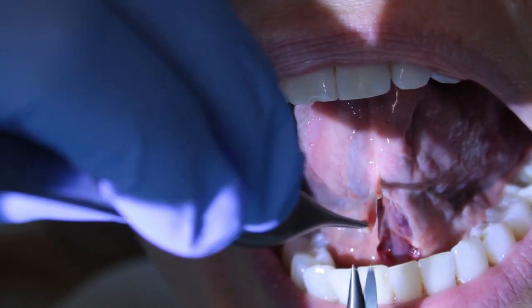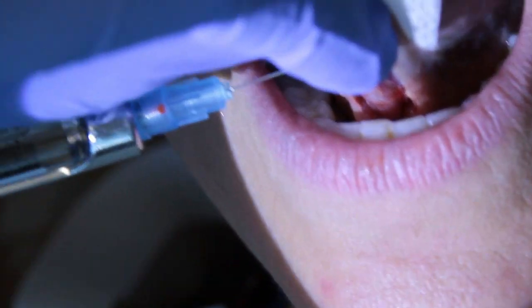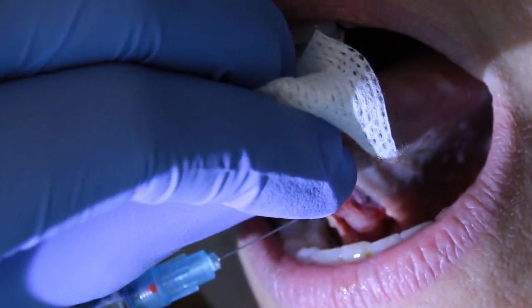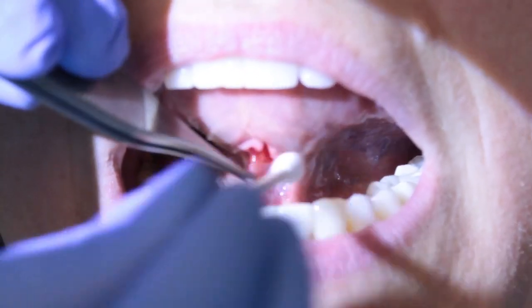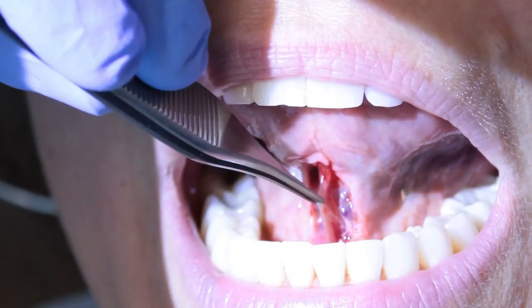No? How's that one? You guys can see these fibers here? Right here. You guys see how tense this is here?